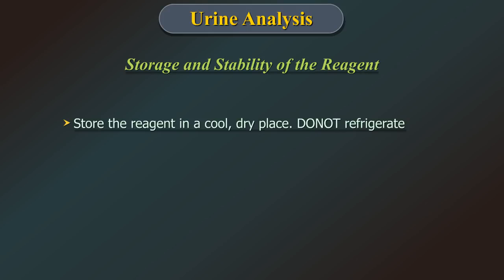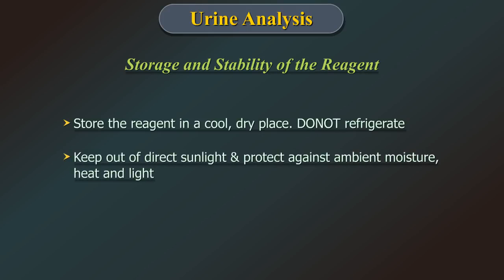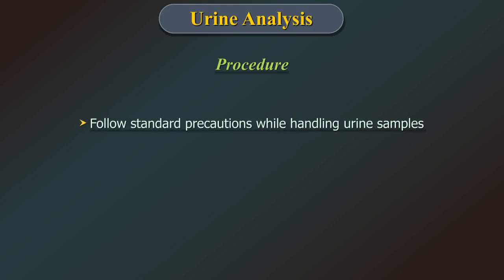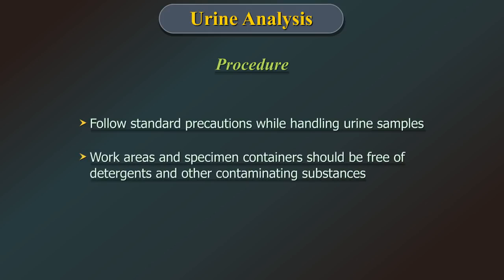Do not refrigerate. Keep out of direct sunlight and protect against ambient moisture and heat. Procedure. Follow standard precautions while handling urine samples. Work areas and specimen containers should be free of detergents and other contaminating substances.